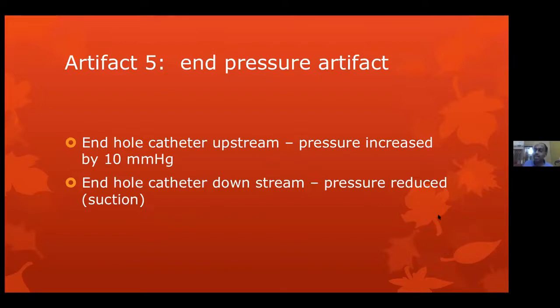Is end pressure artifact like a Doppler effect? Maybe we can call it that, but there is a difference in principle between the Doppler effect and end pressure artifact.